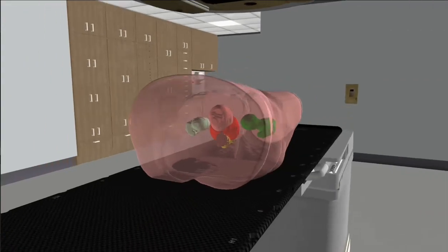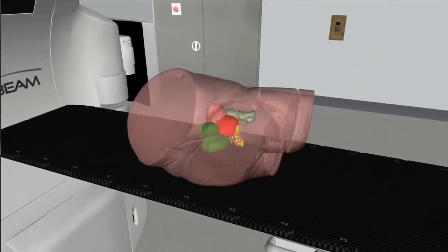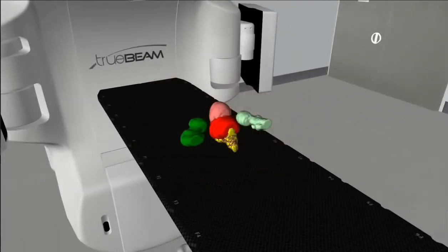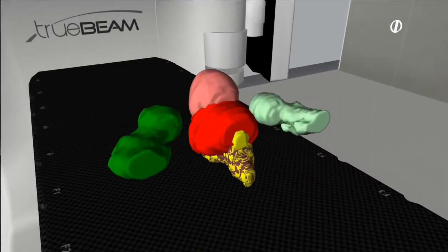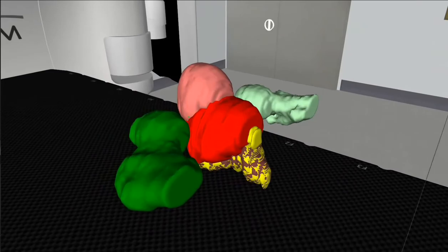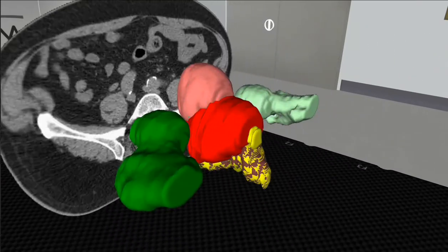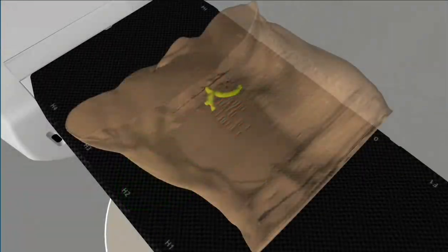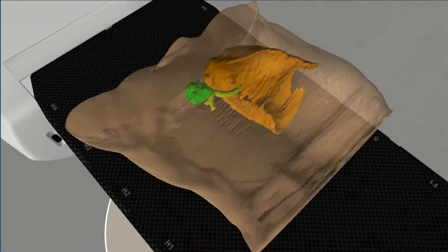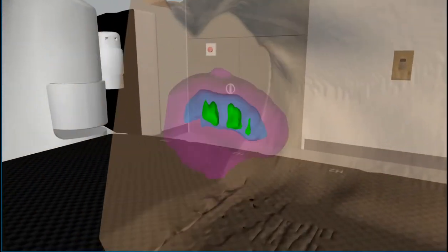As with many undergraduate radiation therapists — or patients when the system is used for patient education — 3D data sets and anatomy can be a new concept. VIRT contains a feature called surfaces, which can be used to display organs, targets and growth margins to increase understanding of unfamiliar images.